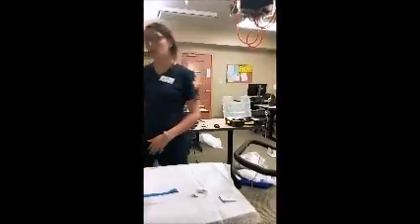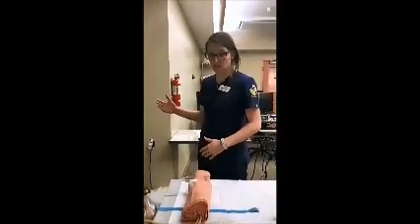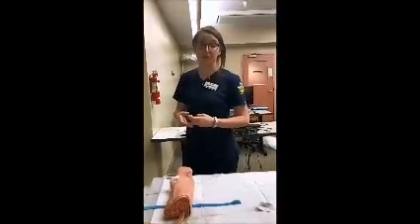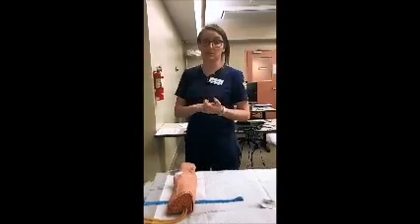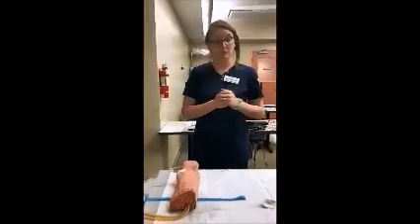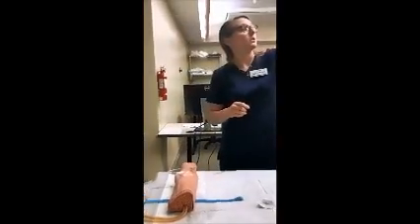All right, so I'll go over and gather my data. I'll check the MAR and see that it is a 1,000 milliliter continuous solution of normal saline. We're going to infuse that over 8 hours. It started at 1:30. We're in here at 2:30, checking it after an hour. We see that it's infused at 125 milliliters per hour. We would probably double check the math too if we were feeling real fancy today. And we can see that the drop rate was set at 21 drops per minute, which we can also double check. And the nurse who started this was kind enough to write that on the bag for us.